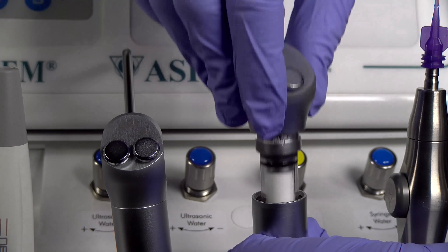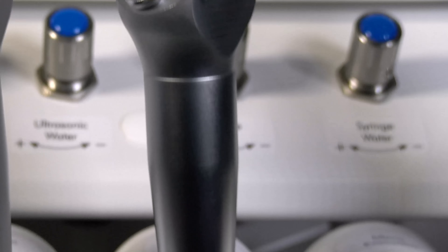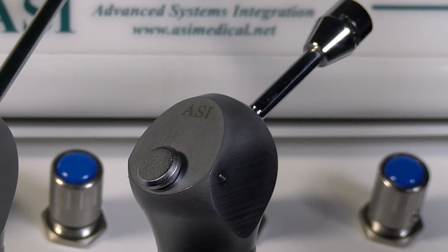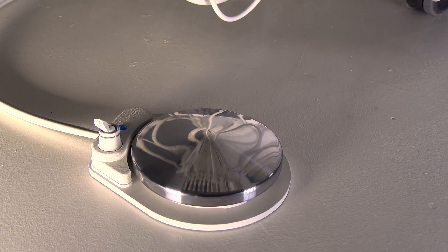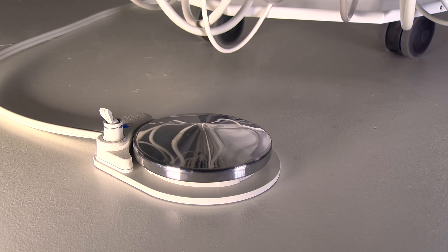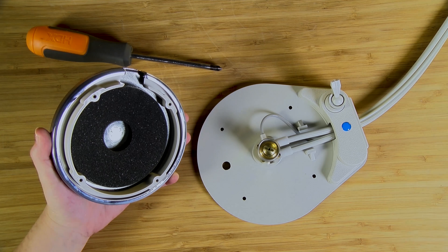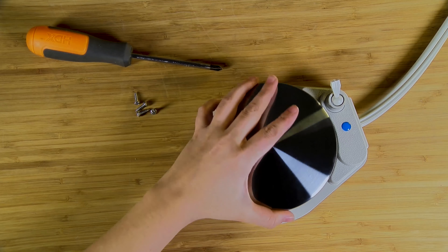The advanced endodontic systems feature a StropCo endo syringe with ultra-low air pressure for use with endo type irrigating needles. The foot control system for operating the handpiece and instruments is a rheostat design for ease of use and features quick exhaust valving with silenced release for quieter use in the treatment setting.